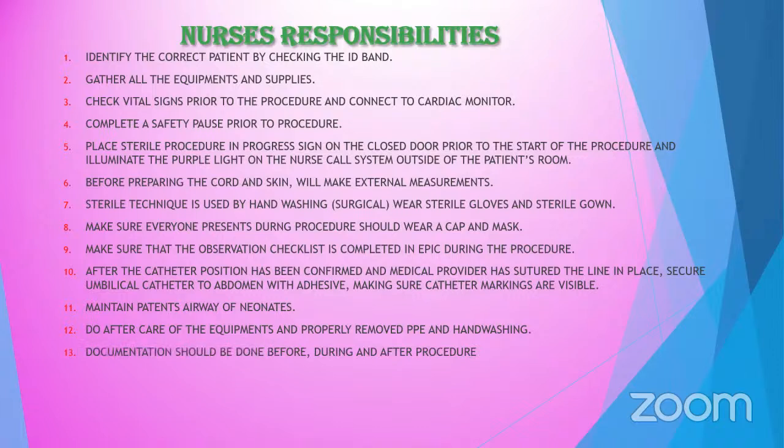Then documentation. Documentation should be done before, during, and after the procedure. So what will we document? The date and time of the insertion, the site of insertion, UVC and UAC, the size of the catheter, the length, and the condition and vital signs before, during, and after. Also make sure the maintenance checklist is obtained and filled out every shift.